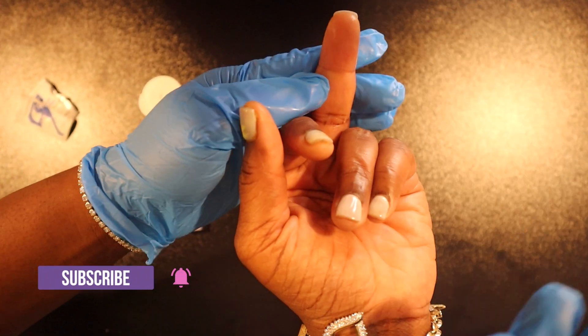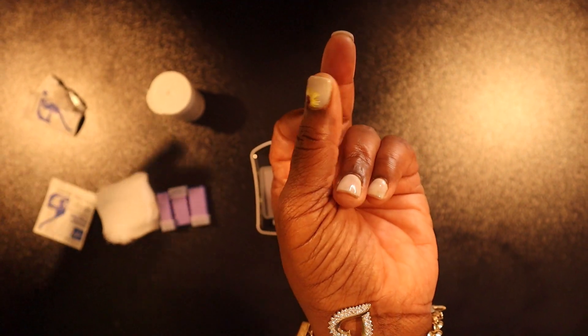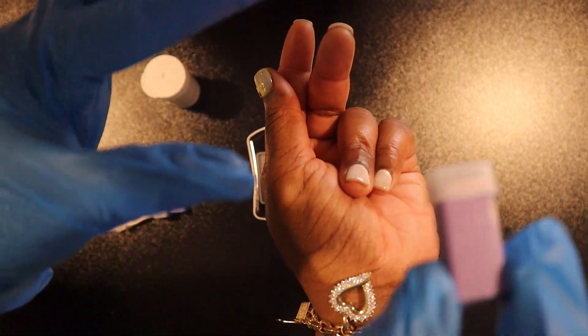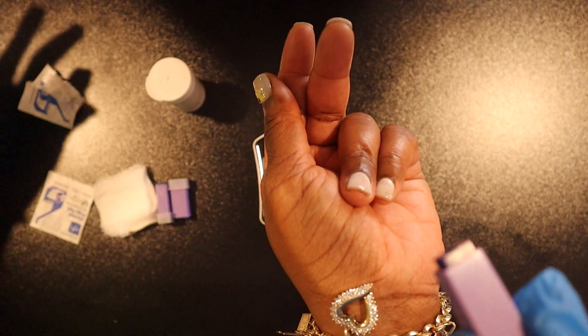You should never use the pinky finger because there isn't enough tissue depth to prevent bone injury. Now let's pick up our lancet and remove the cap.